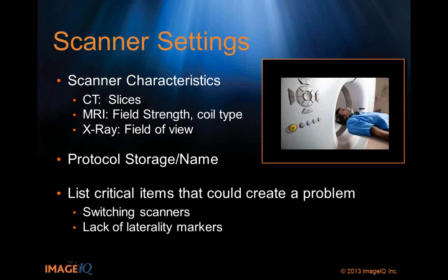So when we talk about the scanner settings, certainly you want to focus on what modality it is. Does it need the 3T MR, or can your 0.3 open work just fine? There's probably a choice there that you want to make. Those are completely different, but technically both MRs, right? So you want to look at those things.